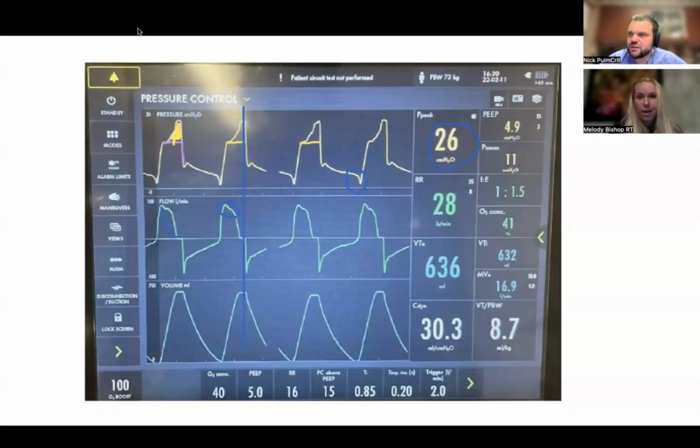I think what you're saying is one of the best ways to deal with ventilator dyssynchrony in general, because half the time we screw it up with our settings, with textbooks telling us we need an I to E of whatever, or an inspiratory time of whatever, or a respiratory rate of X or Y, or a minute ventilation of whatever.